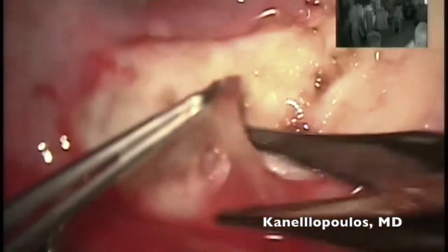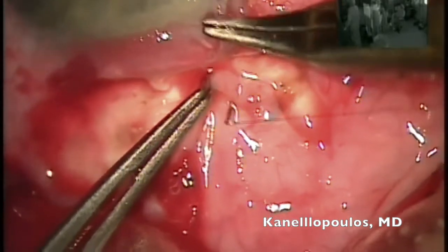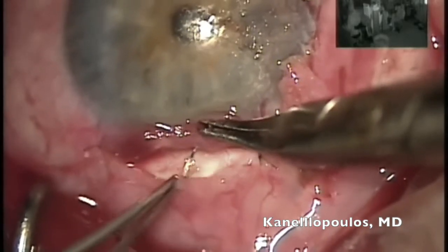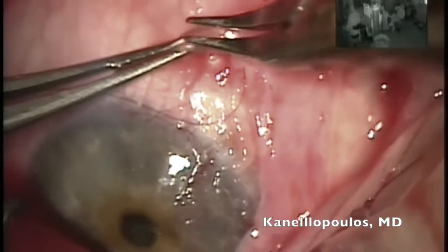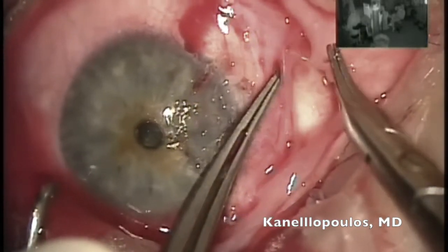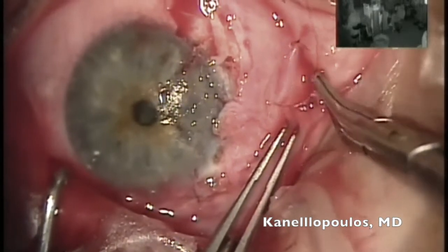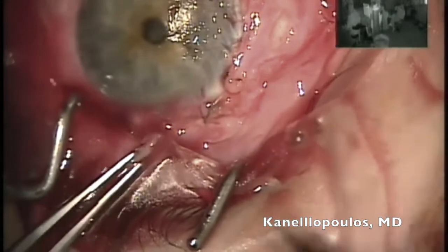I'm going to re-approach, as you will see, with interrupted nylon sutures, the two edges of the conjunctiva left behind from the flap that I removed from the superior aspect of the eye. This is 10-0 nylon — I'll use one more in the middle — thus taking away the possibility of having a pyogenic granuloma, another complication I had to encounter from the area where I had removed a free graft of conjunctiva in the past. Here I've rotated my conjunctiva. Special care not to involve the plica in all of this, especially in the excision of the pterygium — involvement of the plica semilunaris is another area of concern.